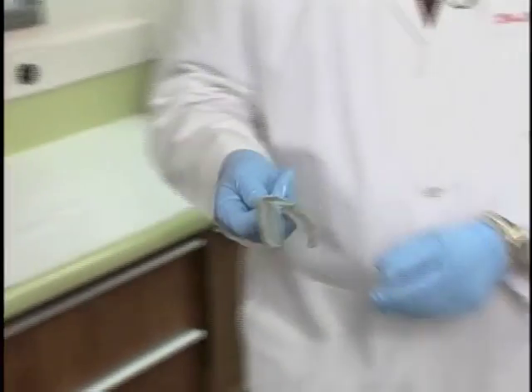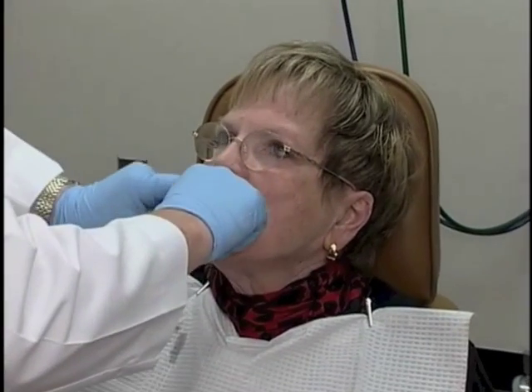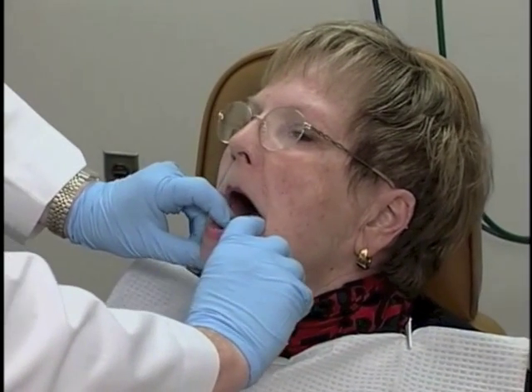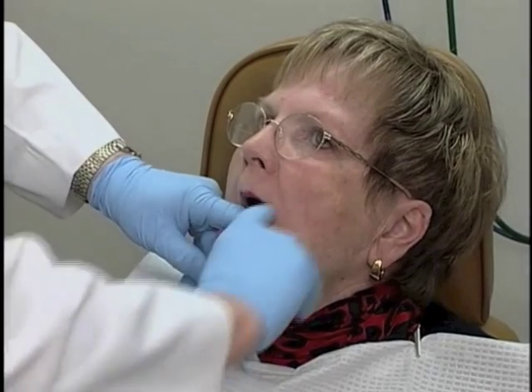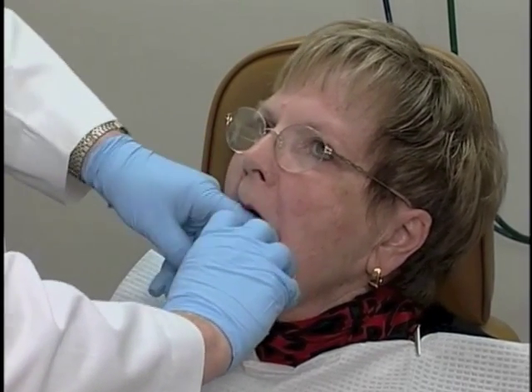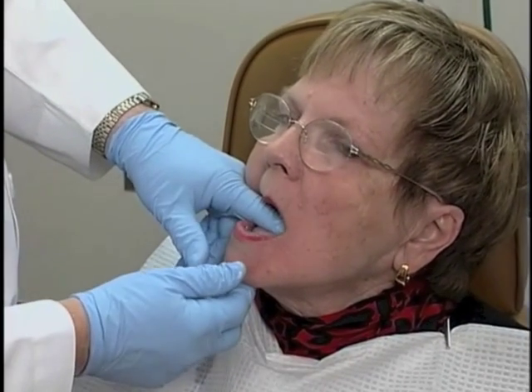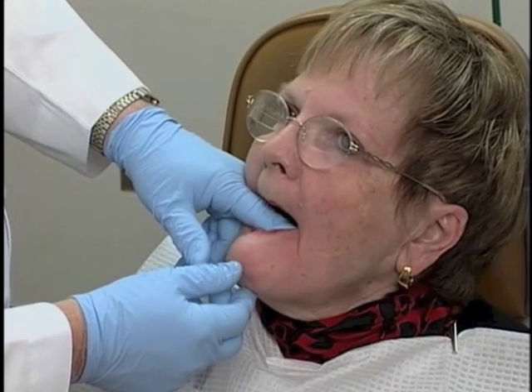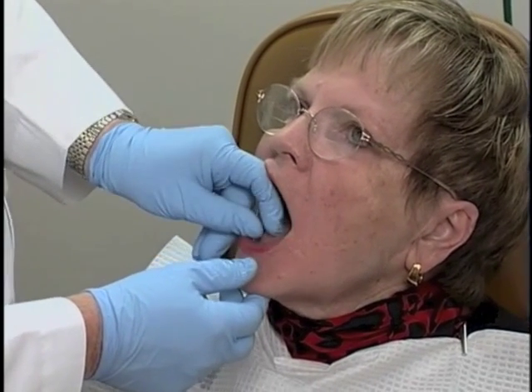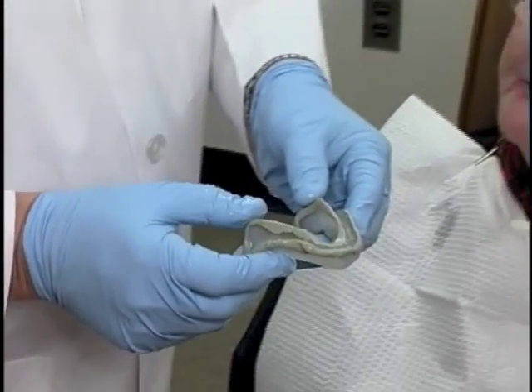And we take it to the mouth. Seat it. And with it seated, I'm going to border mold the right side a little bit and the left side a little bit, and then pull the lip straight up and in. Now I would like you to suck that lip up and in for me. That's good. Relax now. Everything should be good if we got our border molding correct. And yes, looks very nice.